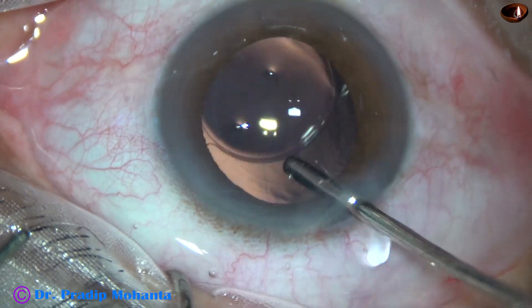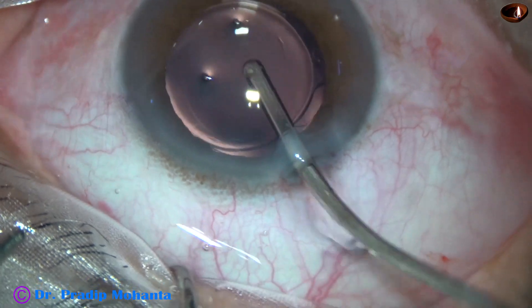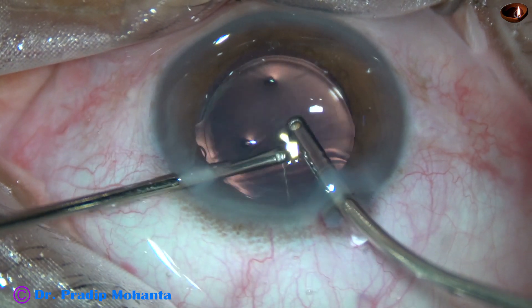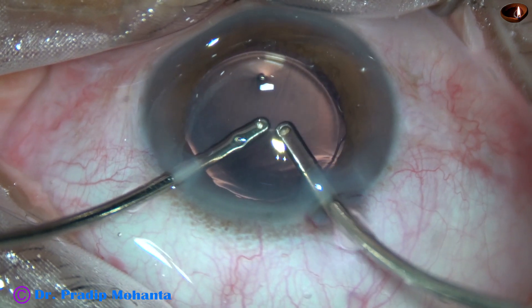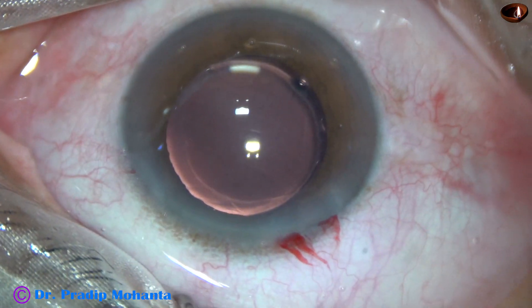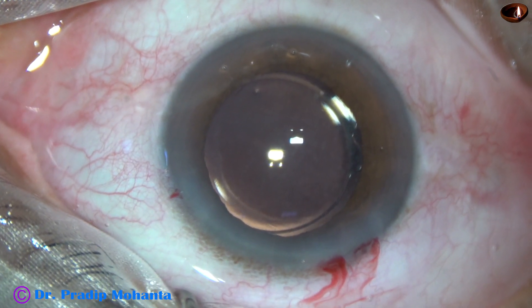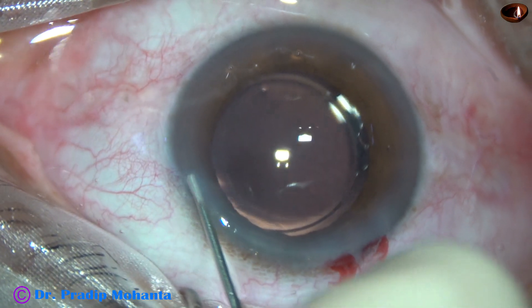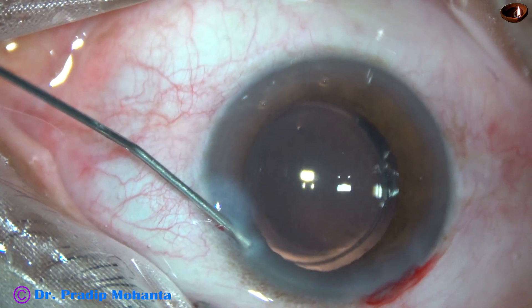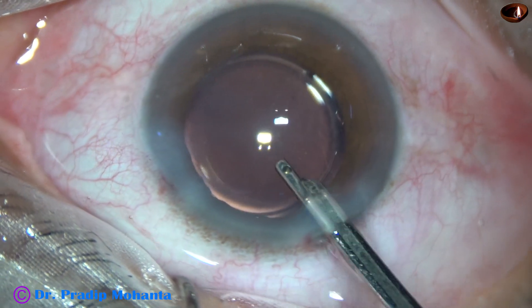Now I am going to remove the viscoelastic from all around — from the capsular bag, from the anterior chamber — using both irrigation and aspiration. When you use the main wound for irrigation, the same principle applies: lift the anterior lip of the main wound and leakage of fluid will be much less. This is closure of the side port, and in this case we have made only one side port. And this is the final lavage of the anterior chamber.